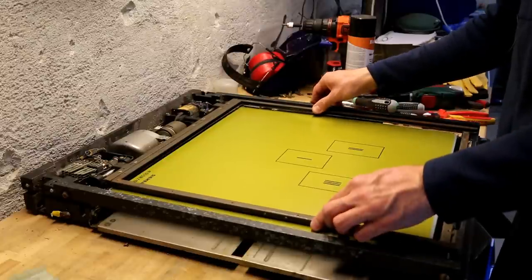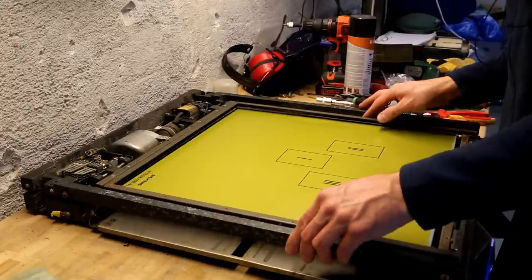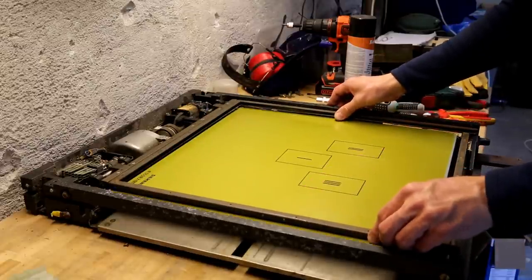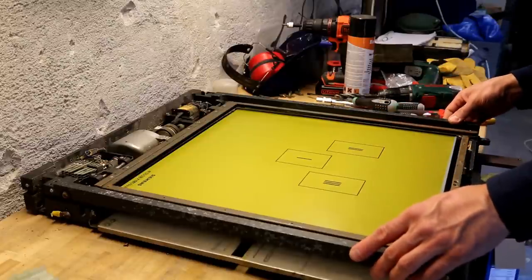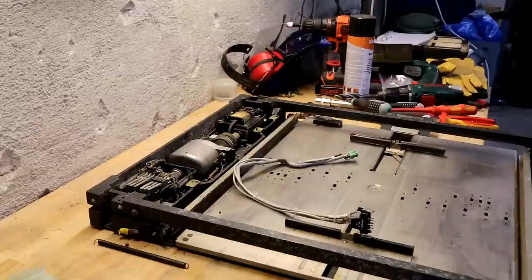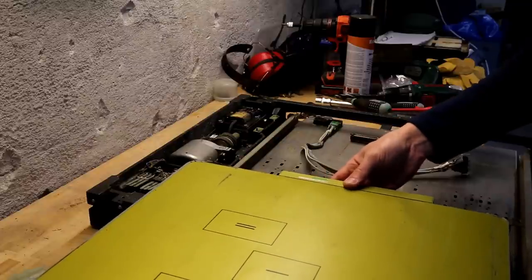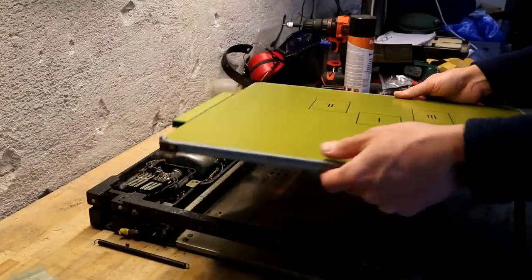As we can see here, we can move it this way. Okay, let me turn the motor there. Okay, so it can't go over the edges to take it out. Yeah, I'll have to spend a little time figuring out how to open this up. So that's taking apart just as much as it makes sense. Now this is quite a funny part, and I will have to see if I can look that part number up that it had on the other side here.